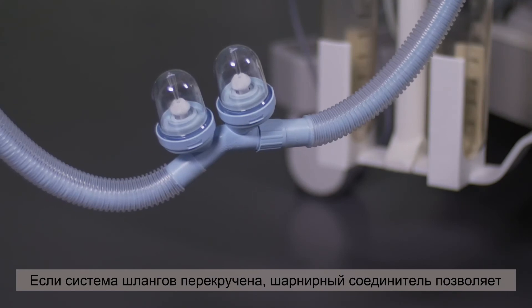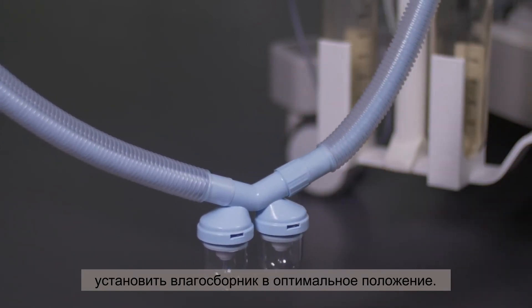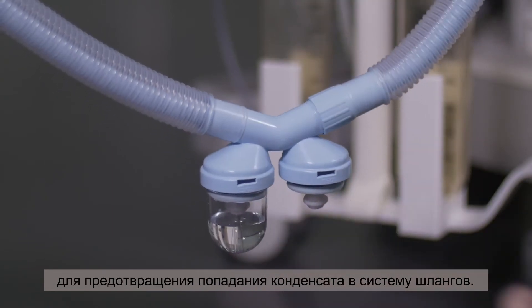If the hose system is twisted, you can use the swivel connector to bring the water trap into an optimal position. It is very important that the two water traps are checked and emptied regularly to prevent condensation entering the hose system.